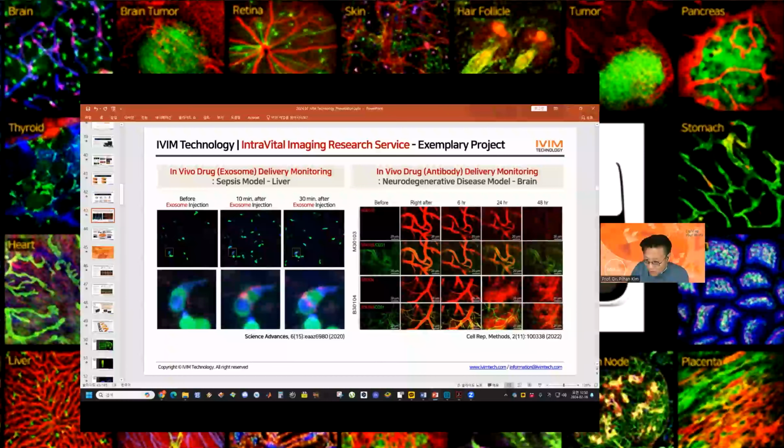If you compare here at 24 hours and 48 hours, we can see more diffusion of this antibody across the BBB to the brain tissues. Anyway, this is how antibody drugs like ADC will look in the tissue. Pilhan, sorry to interrupt you, would you be able to zoom out on that structure and see how much passes through? Can you image, because this antibody should probably get internalized and some of it probably leaked out, right? Yes, yes. You should be able to see those things too, right?